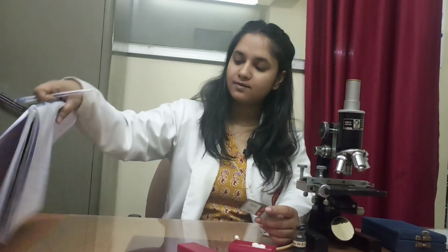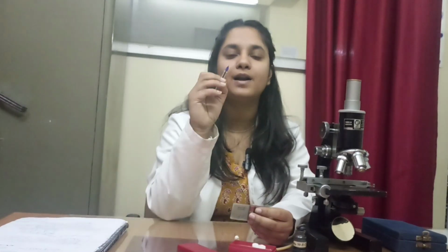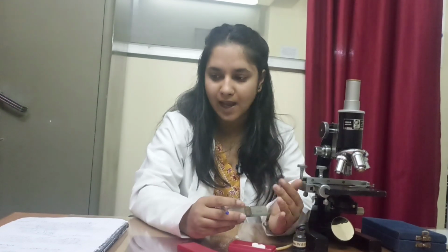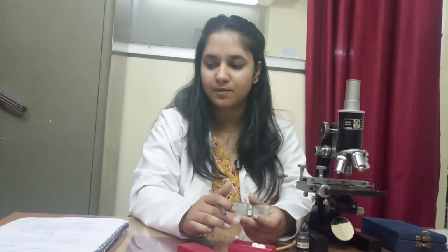Like according to this, we can also calculate this directly with the help of a formula. The formula is number of cells counted multiplied by dilution factor upon area counted into depth of the fluid. The number of cells is n, dilution factor 20, and area counted is 4 into 1 square mm into depth of the fluid, 0.1 mm.